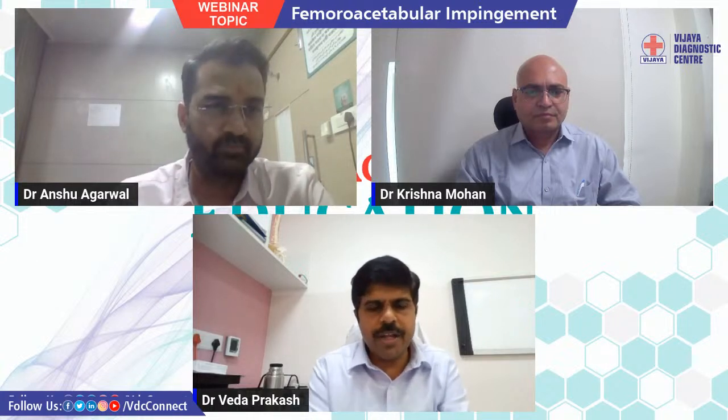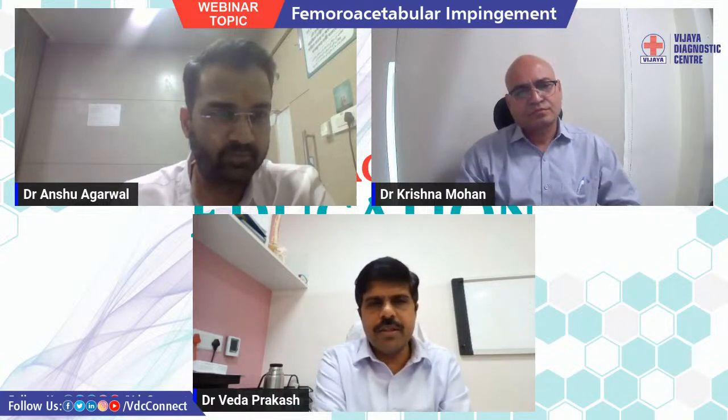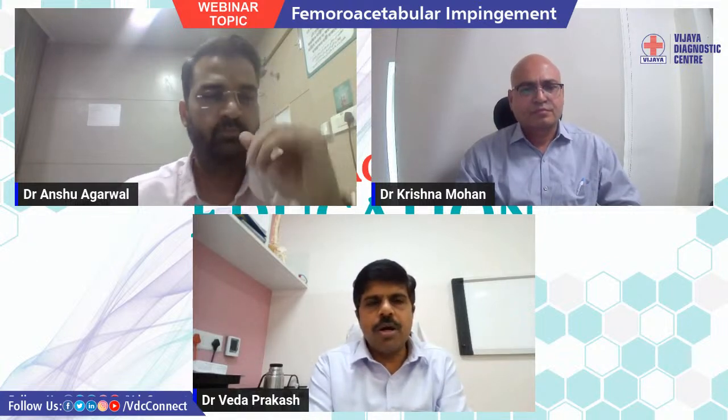The second aspect I wanted to ask was, when you go back and look at these MRIs which were done for FAI, most often we may ask for an arthrogram sometimes in these patients, a hip arthrogram. How much percentage of cases do you think will be missed if you do not do an arthrogram? Are there cases where you would see them only when you do an arthrogram, or is it possible to see them in a plain MRI with a high quality MRI? Just wanted an opinion from the radiologist group.